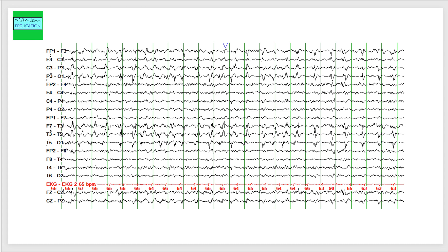When you see periodic lateralized discharges, this could be seen in a postictal state. This could be seen from a subacute insult to the cortical surface, such as herpes simplex encephalitis can give you periodic discharges, periodic lateralized unilateral discharges. Brain abscess can give you these findings. A brain tumor can give you these findings. A subacute stroke can give you these findings. These findings are not specific for the underlying etiology, but can be seen in subacute insult to the cortical surface.